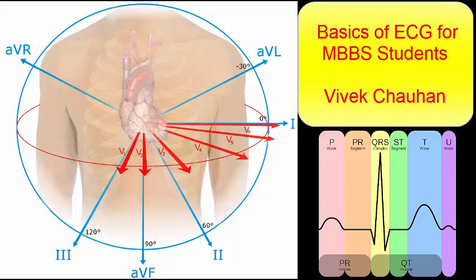ECG for MBBS students. This lecture covers the basics for MBBS students.